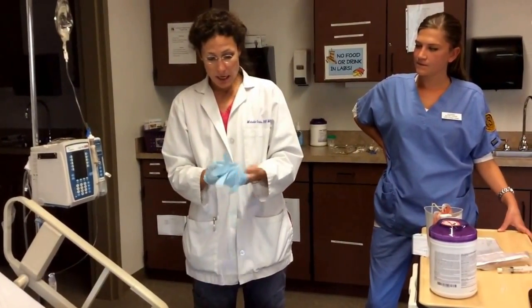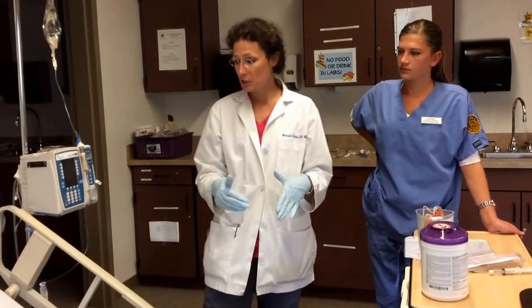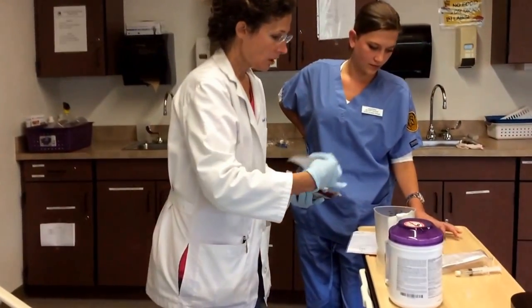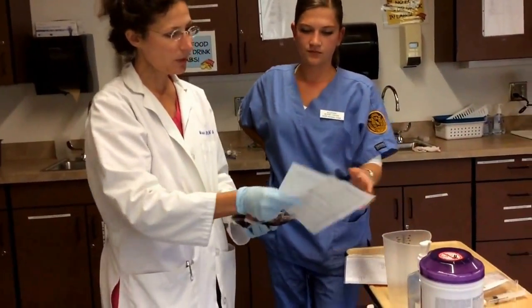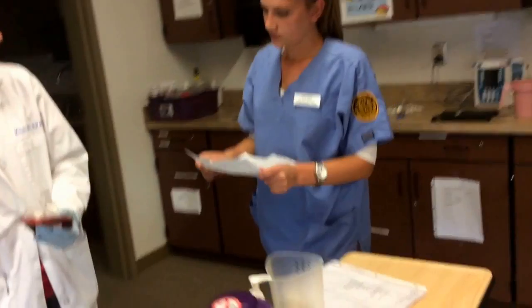So at this time, I would have either myself, while I was getting the blood, or a nursing assistant check his vital signs so that I have his current vital signs before starting the blood. And this is the paper we'll use. Okay. So we're going to verify information from the unit, from the lab, and from his name bands.